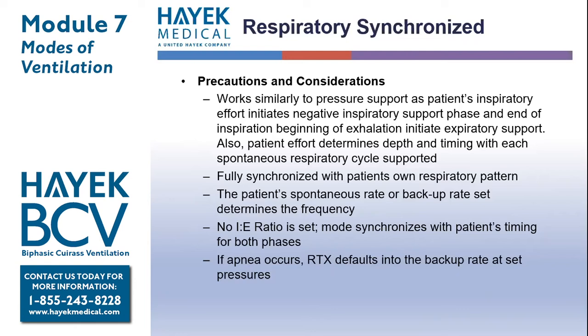No IE ratio is set in respiratory synchronized. The mode synchronizes with the patient's own timing of both phases of the respiratory cycle. If apnea should occur, the RTX defaults into the backup rate at set pressures.